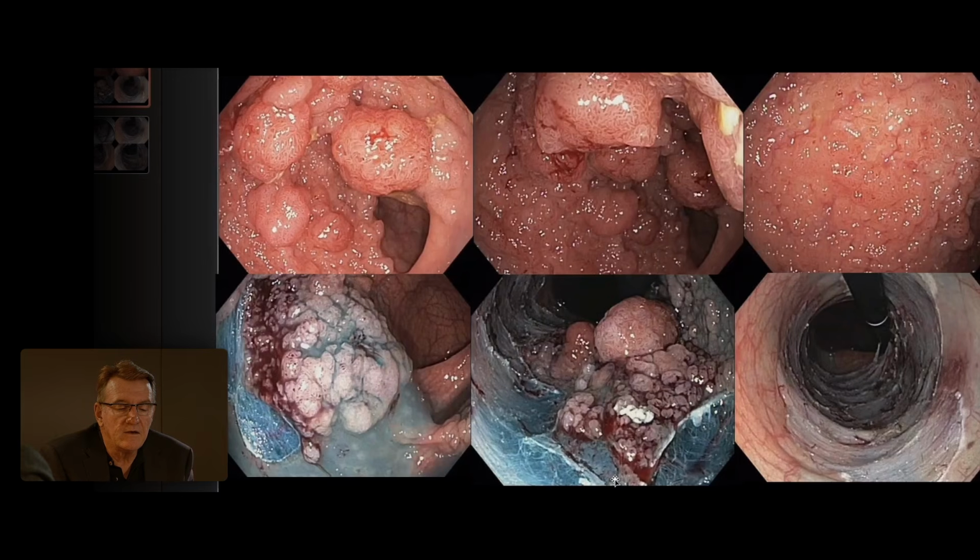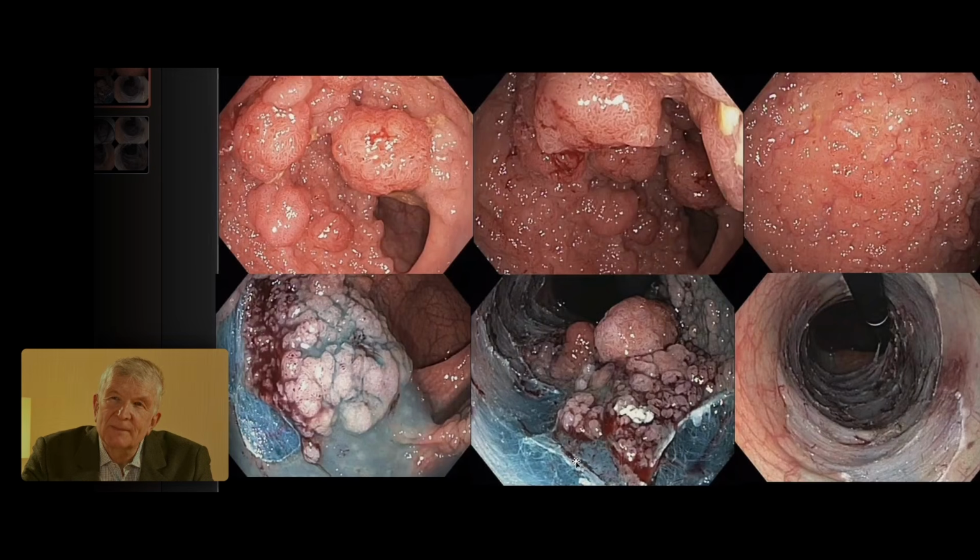But here we see this crisp white line. That is the line of excision of the muscularis mucosa. So it's like the target, but above the target. And here, this lacy capillary, this is incomplete mucosal layer excision here.